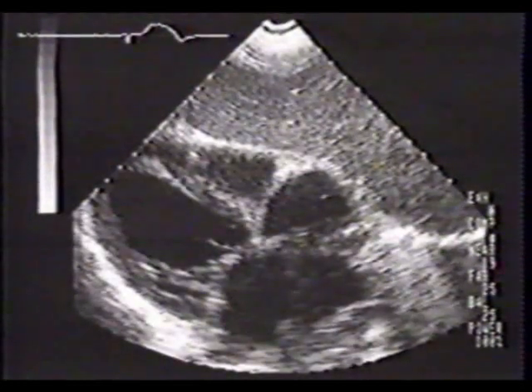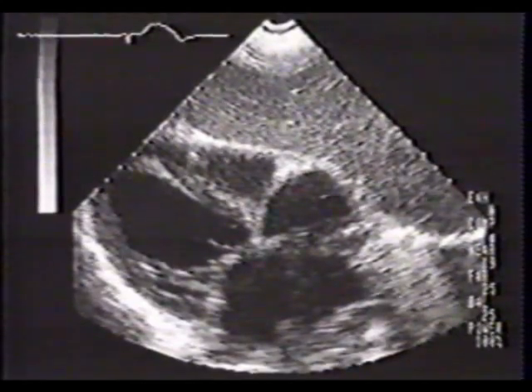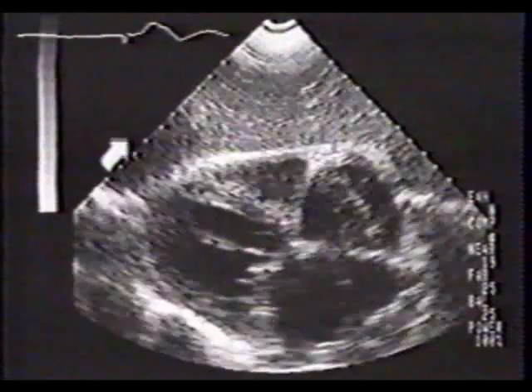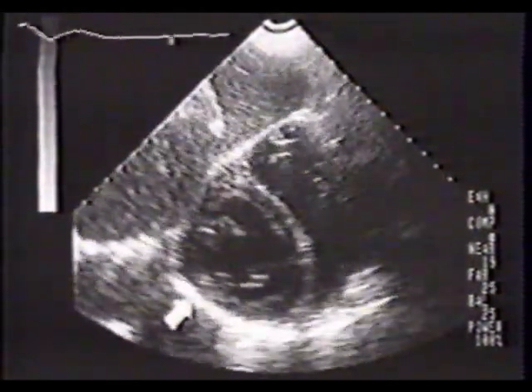Now the compressions have been held again. The pacemaker is only capturing intermittently, but even with capture, there is no myocardial contractility. This is true electromechanical dissociation.